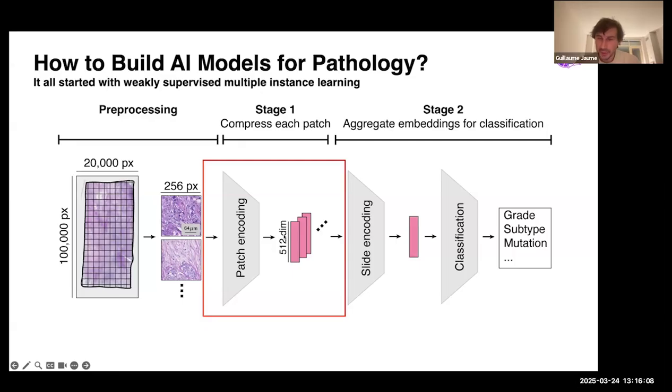So as you can imagine, training this, even if the pipeline is pretty easy, is no easy feat. And the reason is typically it requires a lot of data, and it is not always feasible. If you want to do Gleason grading of prostate biopsies, we have a lot of data. So it's kind of an easy situation. Biopsies are rather small images for pathology, again, small in quotes. So we can do it. But considering the complexity of all the problem statements that we have in oncology, we keep getting more and more complex. It's pretty much impossible to develop a new solution from scratch.